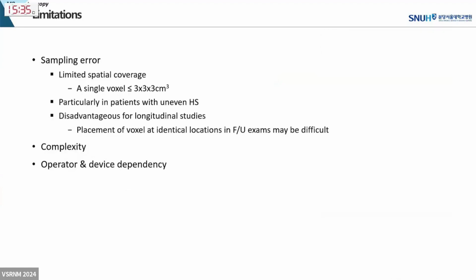However, MR spectroscopy-based PDFF can be challenging for several reasons. First, sampling error may be present owing to its limited spatial coverage, which can be problematic in patients with uneven hepatic steatosis and for longitudinal studies. Furthermore, MR spectroscopy is limited by its complexity and operator and device dependency.